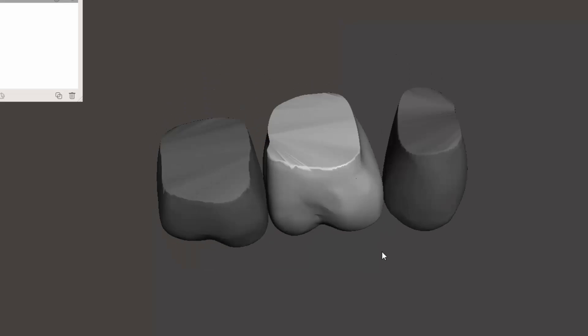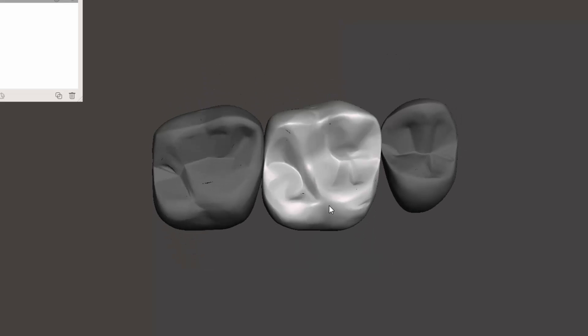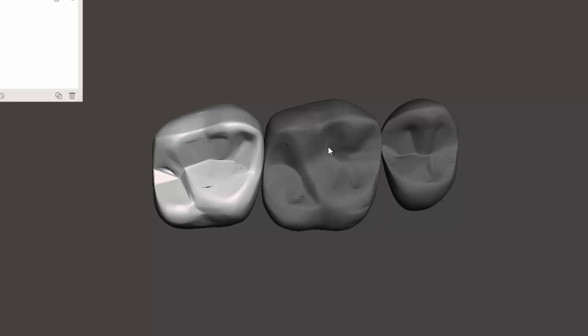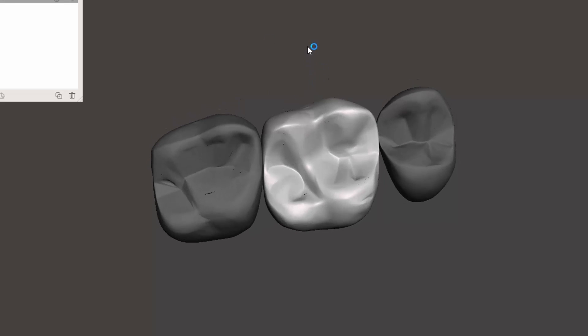Creating face groups is what I'm going to show you and how to use those to refine anatomy. Basically, I'm going to just mess with tooth number three, or upper first maxillary molar.